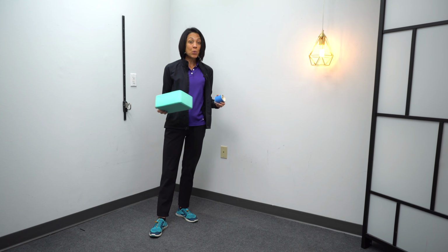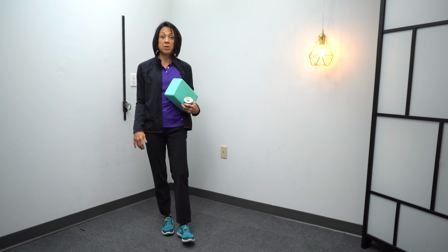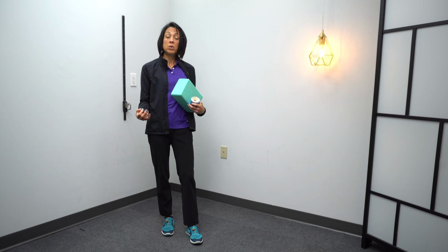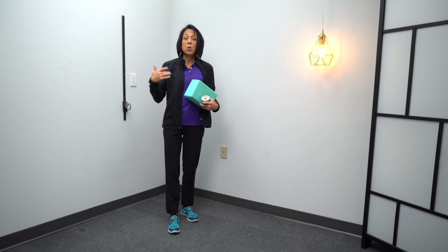All right, now we're going to get into tools that I think are helpful when loading a spastic leg. So some things that we want to be thoughtful of when we are experiencing some involuntary pointing and rolling to the outside when we're loading the leg is that in some cases, when you load a spastic leg, it's going to make the spasticity worse.